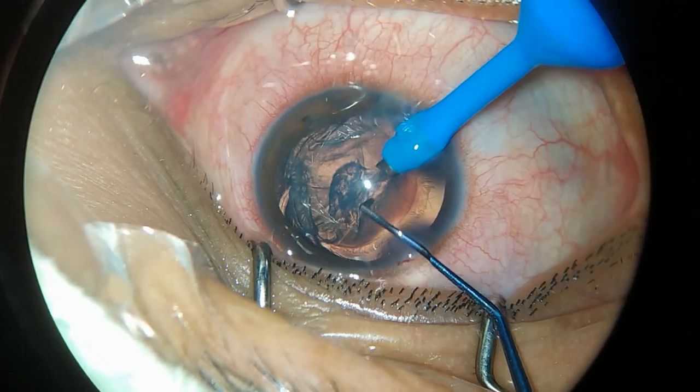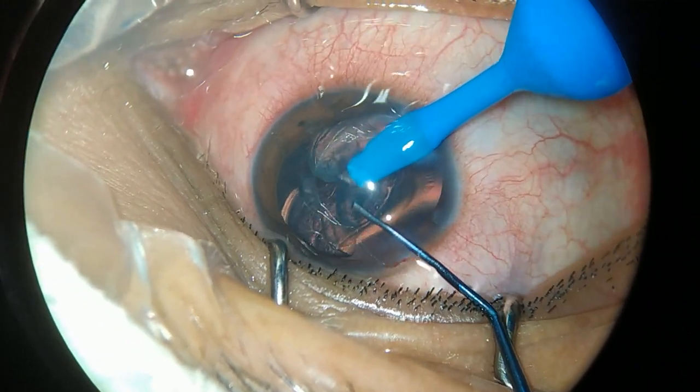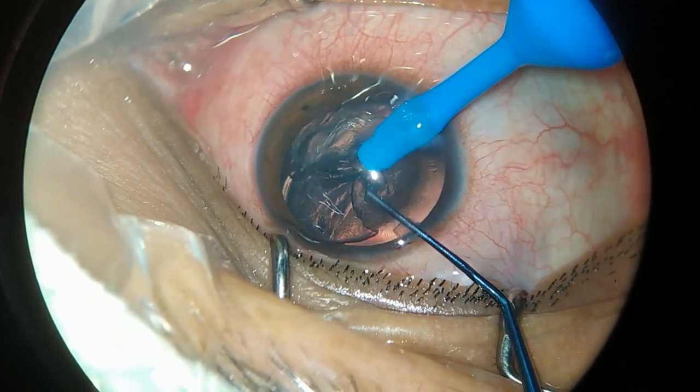This is a young patient, so we are able to complete the lens aspiration smoothly without use of any phaco energy.